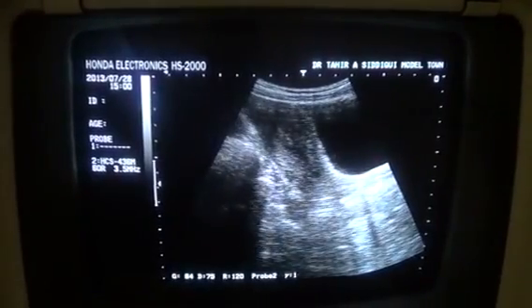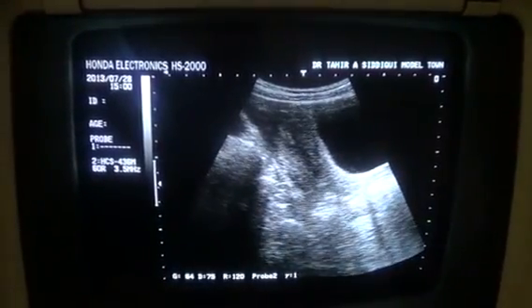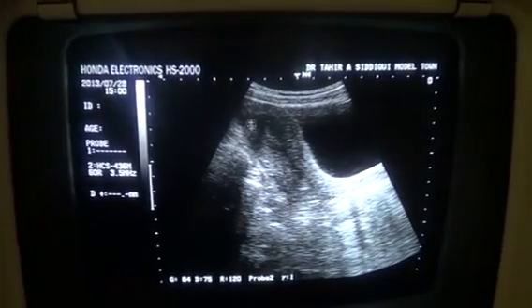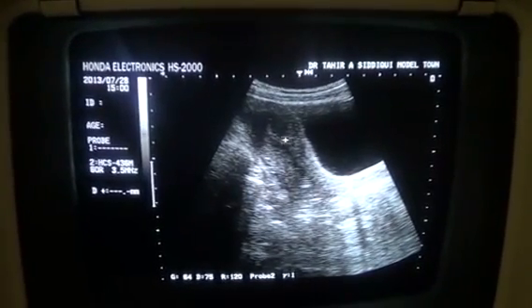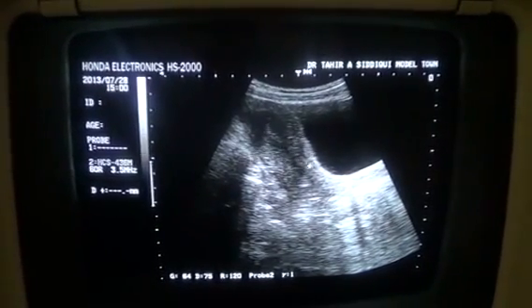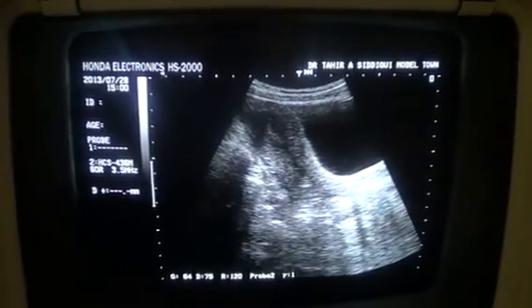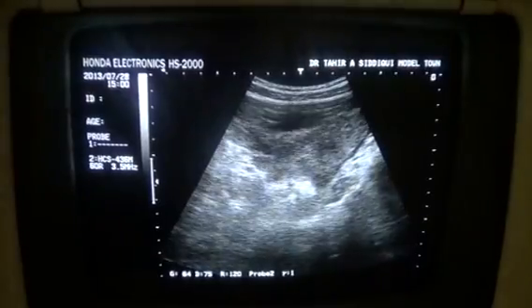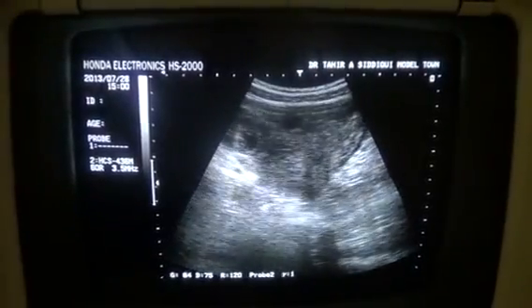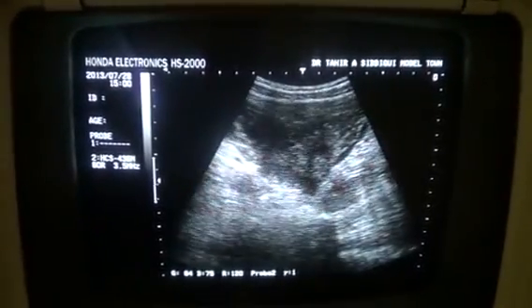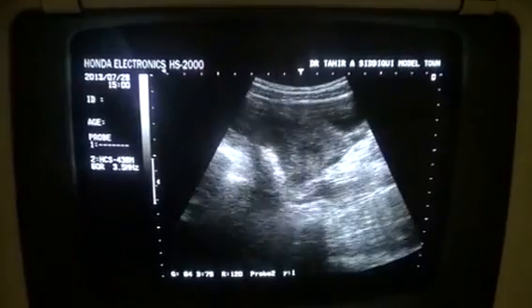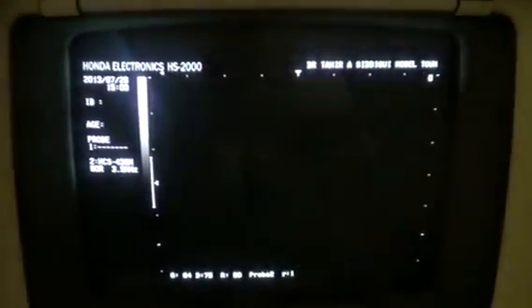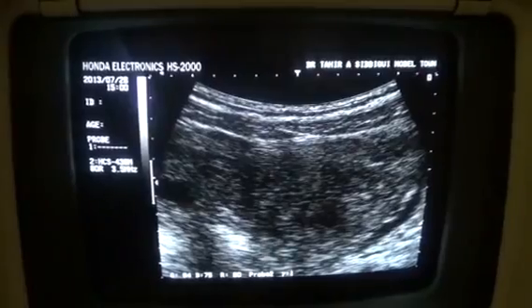This is the uterus. She is married and the uterus is normal inside. This is the endometrial canal, this is the urinary bladder. On the right side, as I move the probe properly, I do see fluid posterior to the uterus.